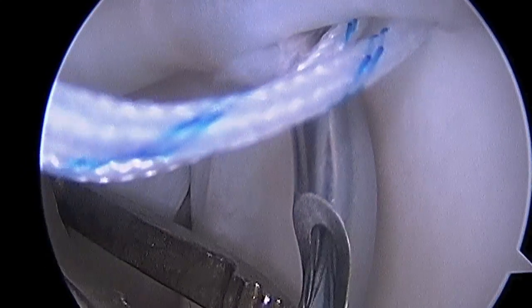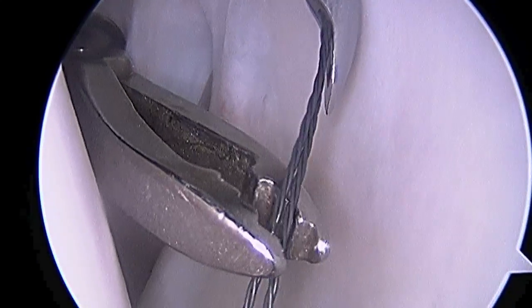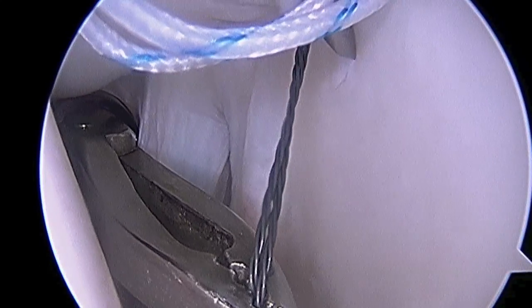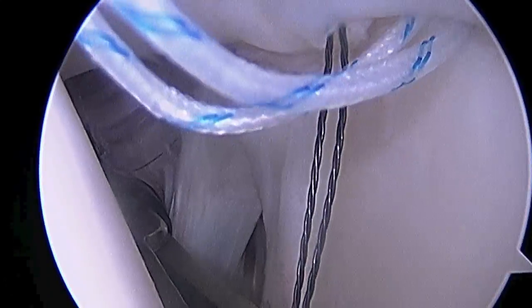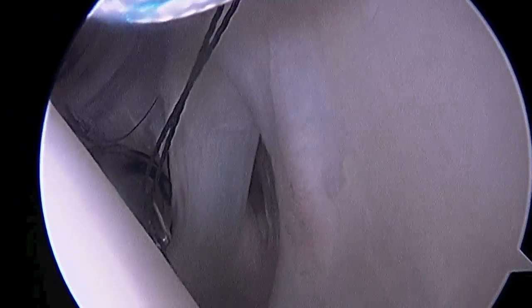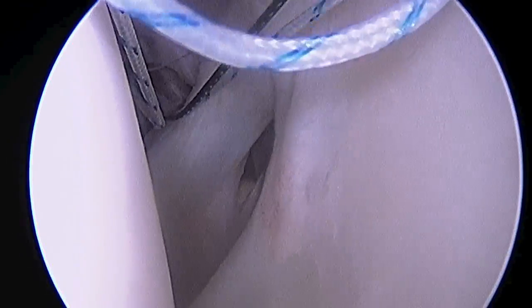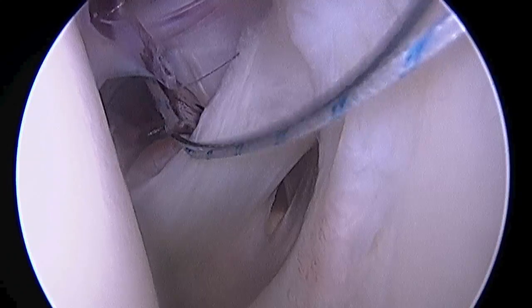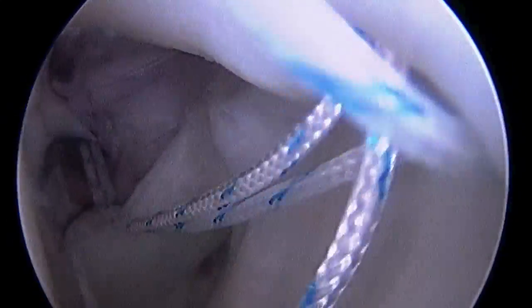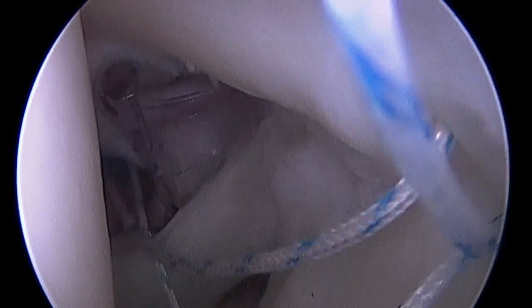Now we're going to use a little bit different device — it's a curved suture passer — so that we can pass from the anterior portal again. My assistant is retrieving the cable passer out the anterior portal. Then we'll retrieve the stitch that we want to pass through the tissue. We'll place that in a little loop of the cable at the end, and you'll see how I'm able to pass the suture through the labral tissue with that.